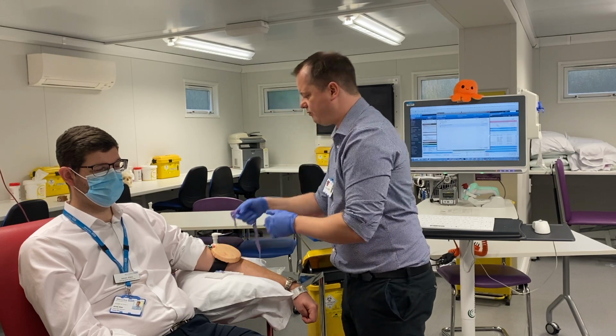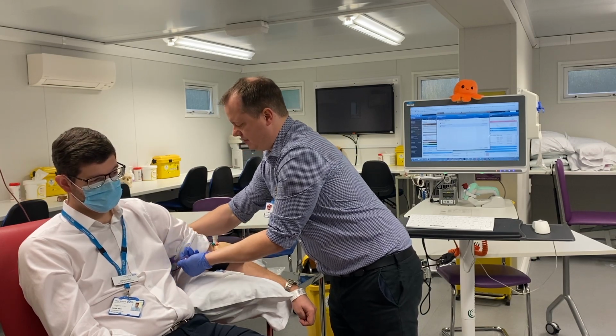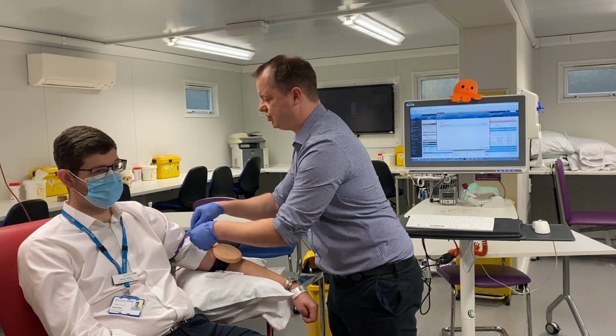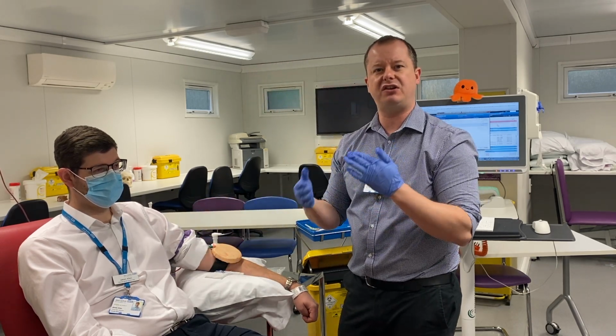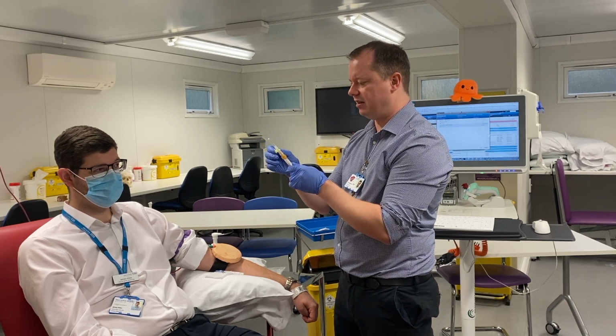I can then now wrap my tourniquet around the patient's arm because I am ready to go ahead. Sometimes it's a good idea just to do a little visual check or a run through when you get to this stage, just so you don't get lost in your actions. So I'm going to take my needle and my bottle.